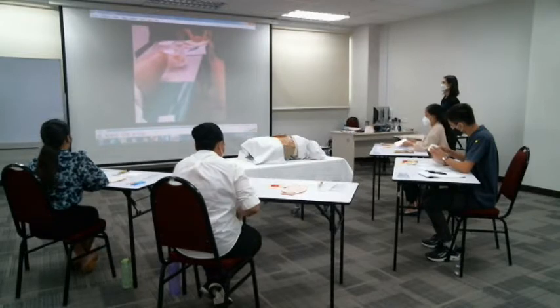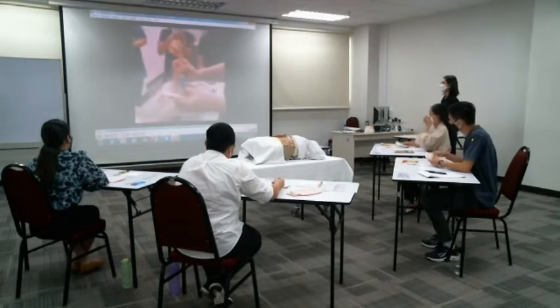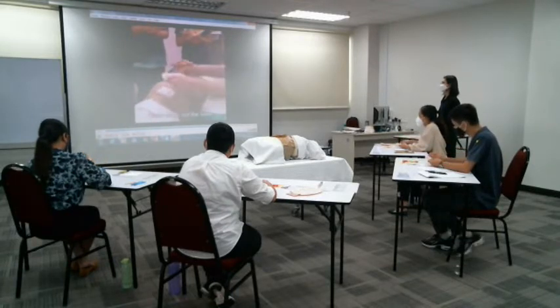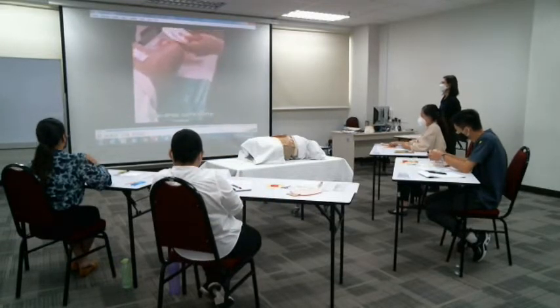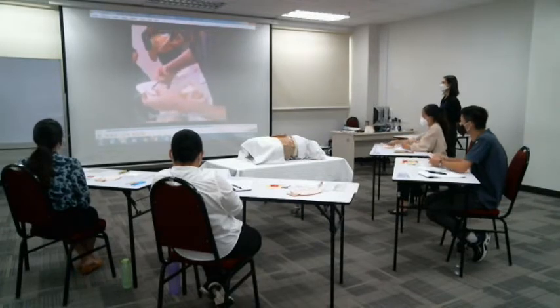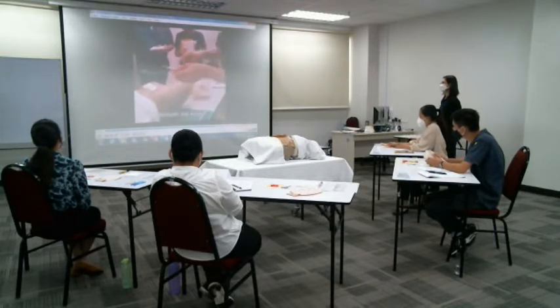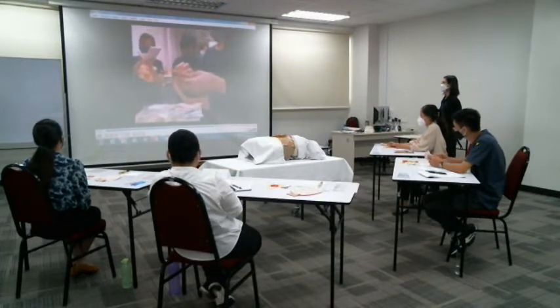After that, you make the hole at the center. When I want to put along here, I should try the angle so that it is the same. First, I cut, then I smooth it. Okay, make it smooth. Check.